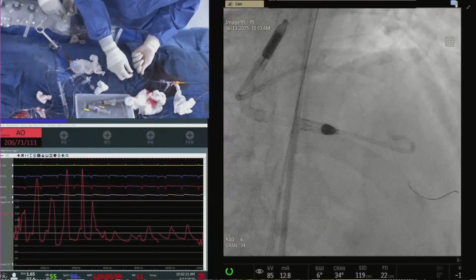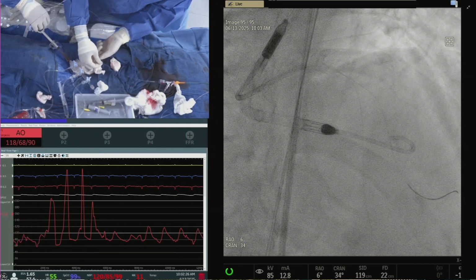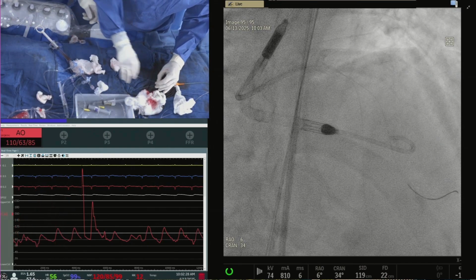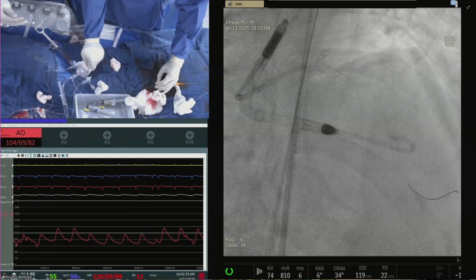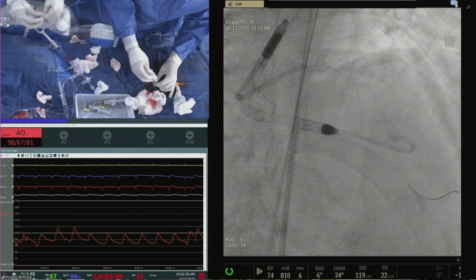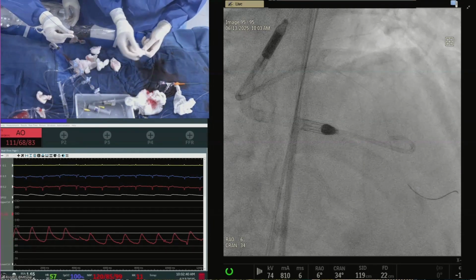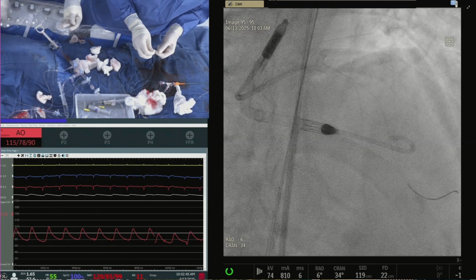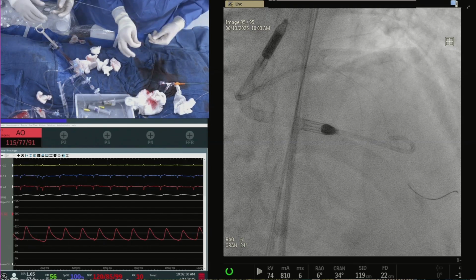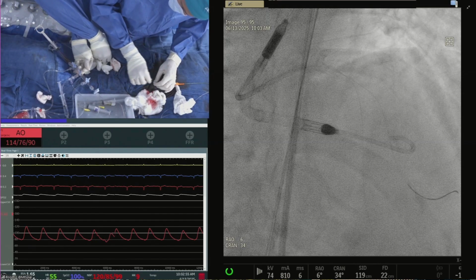All right. So, Dr. Kinney, you've dilated the LAD, right, first? And now you're going to do the diag? Yes, we will go to the diag, distally. Remember, you had some issues, the balloon did not cross. So I'm going to go with the 2.0 balloon. Dilate a little bit there. IVUS is ready for the LAD. Okay, and then we can decide, did we do enough for debulking or do we still need anything more on the proximal LAD? That diagonal will actually be hard to cross.